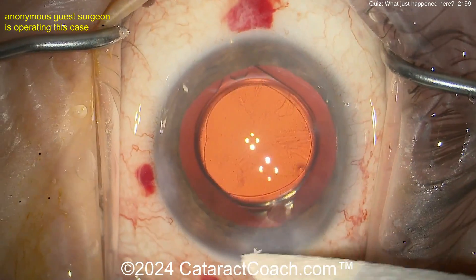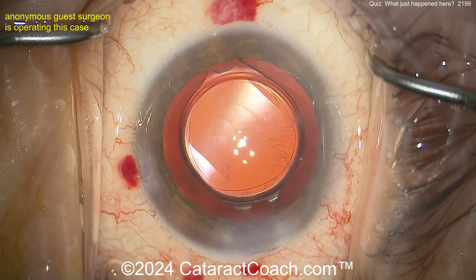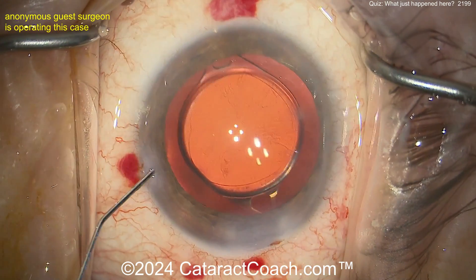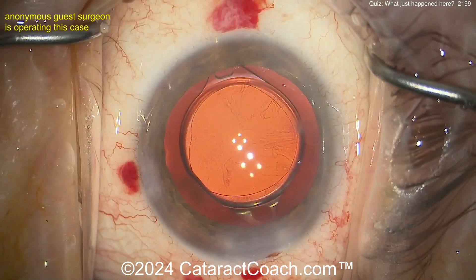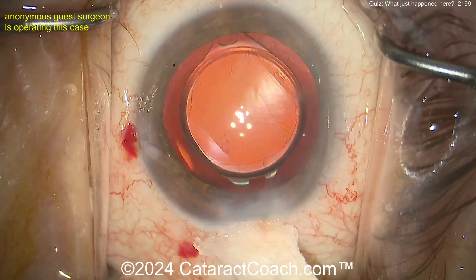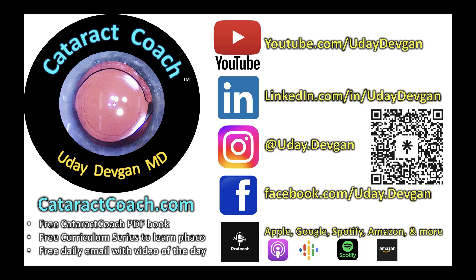Nice case here. At the end, what's that bleeding at the top of the screen? That's from grabbing with the conjunctival forceps when you made the main incision — I bet you did. Don't do that anymore. Your patients — now you're going to be in private practice — they want a beautiful cosmetic result too.